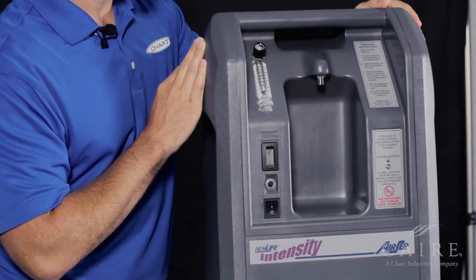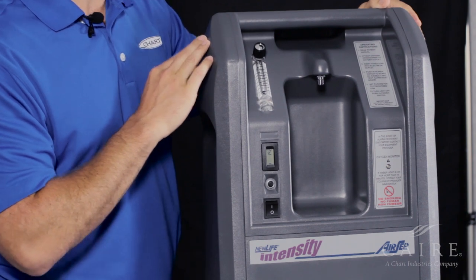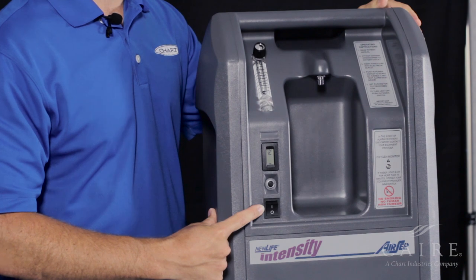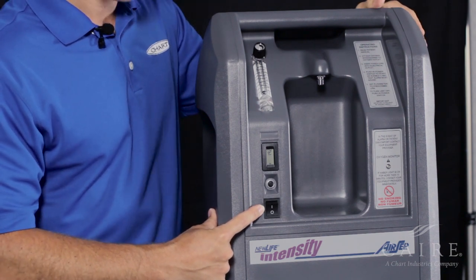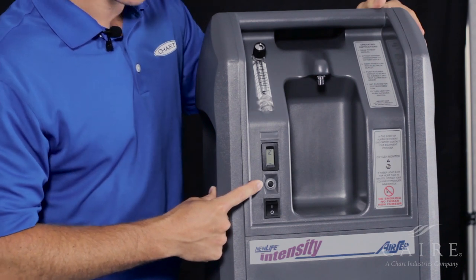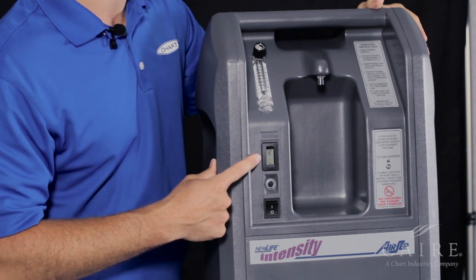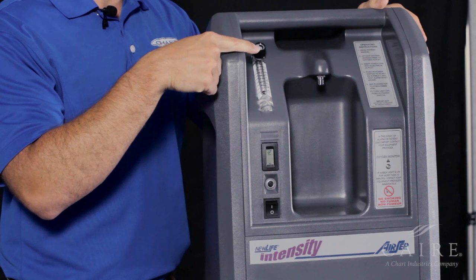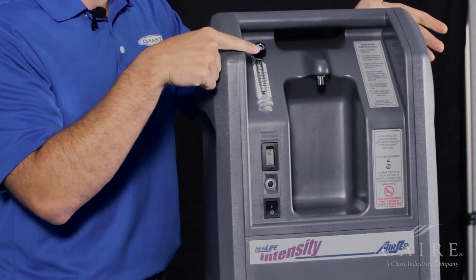First thing we're going to do is point out the different controls on the front of the unit, starting on the front left as you're facing it. You're going to notice the on/off switch, which gives you power to turn the unit on and off. Right above that is the reset for your breaker in case it ever trips. Right above that is your hour meter, and then right above that is your flow meter, which you can adjust depending upon your prescription.